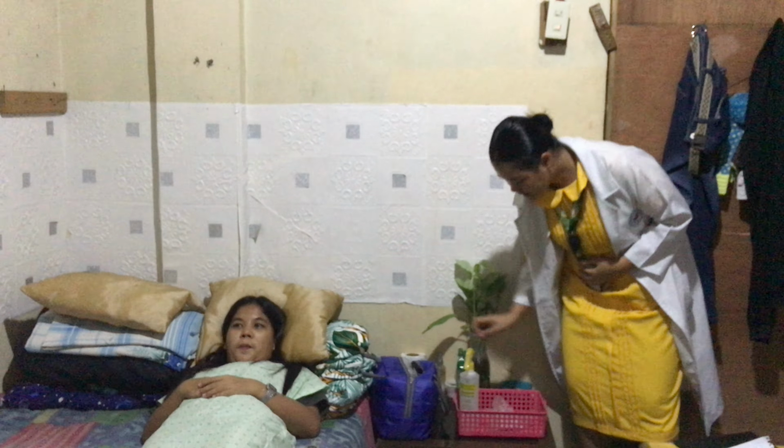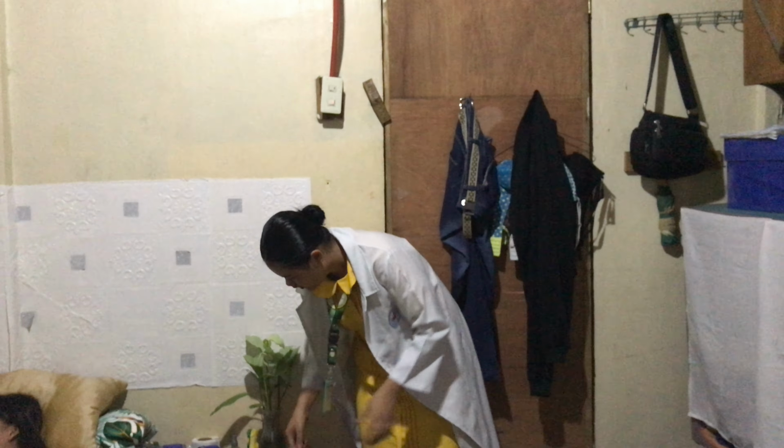And then discard it. The reusable materials are the set of test package here, the pregnancy test kit here, and also the alcohol. I'll just discard this also. The rationale for this is to maintain the orderliness and cleanliness of our environment.